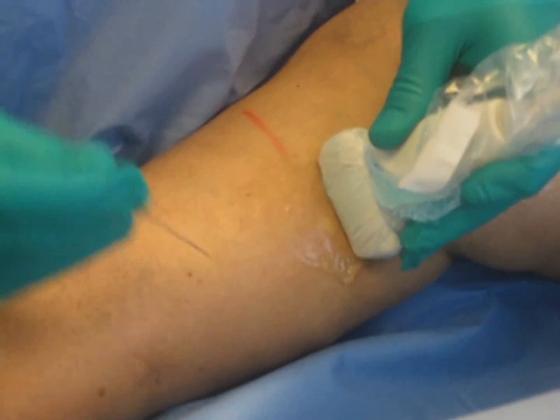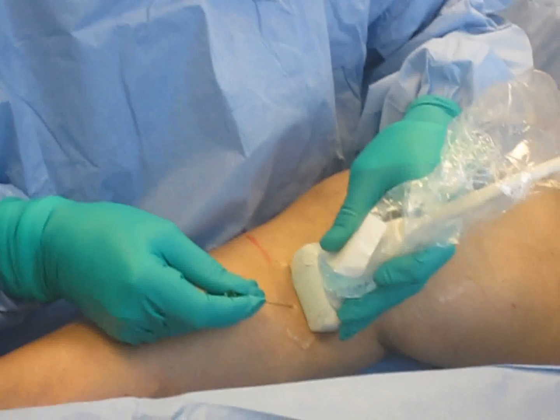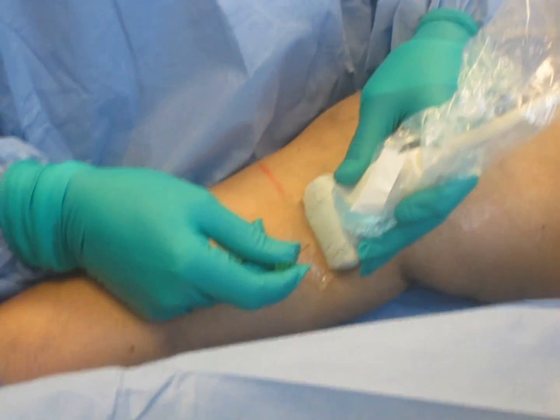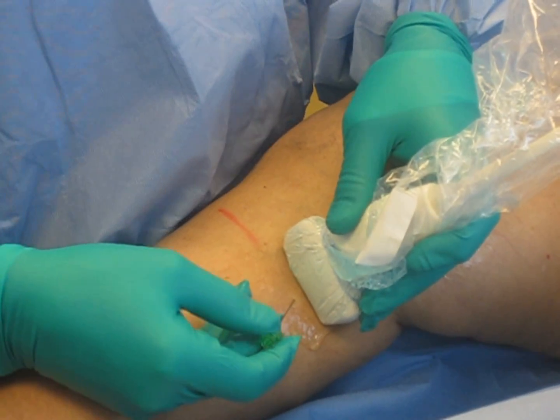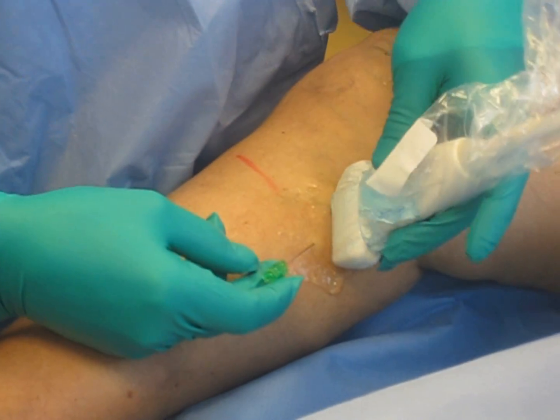We usually give every patient a little tiny heads up — she's a little sensitive today. Patients aren't quite that sensitive typically. I'll give her a little bit of heads up.